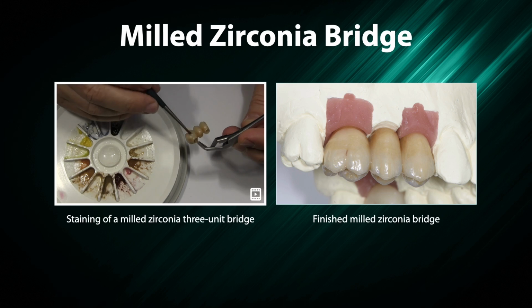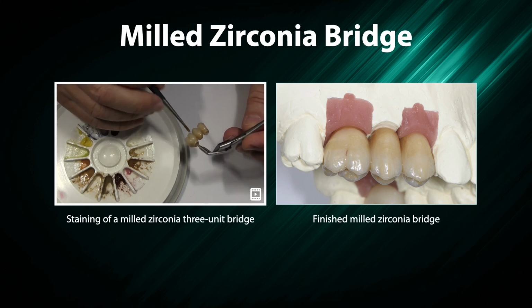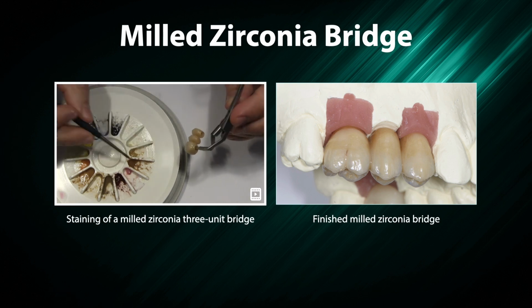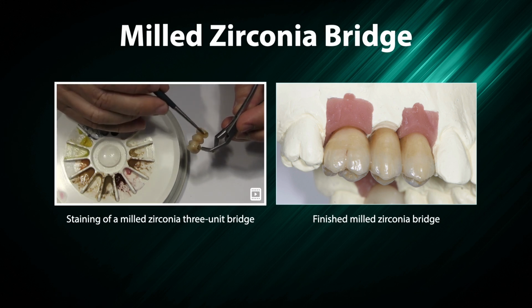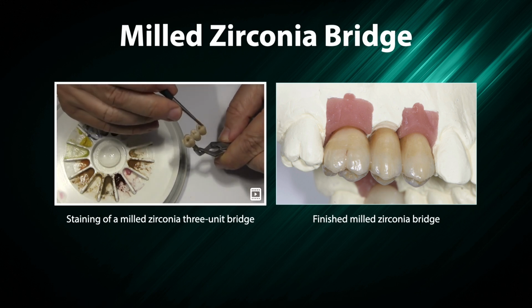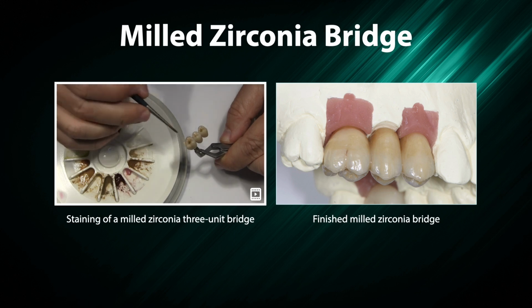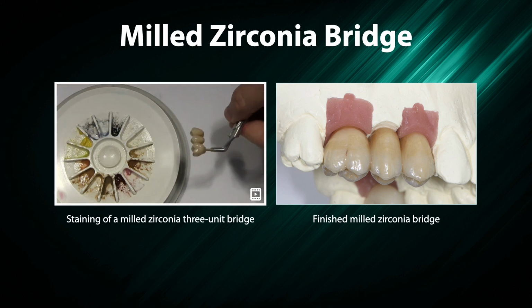Milled zirconia bridge. Staining of a milled zirconia 3-unit bridge. On the right is the finished milled zirconia bridge.